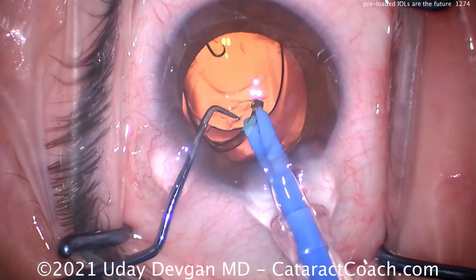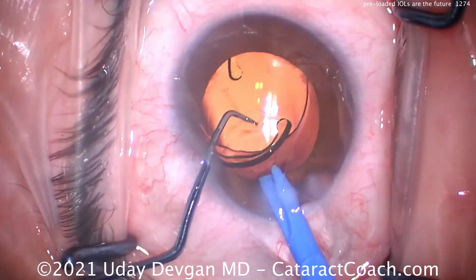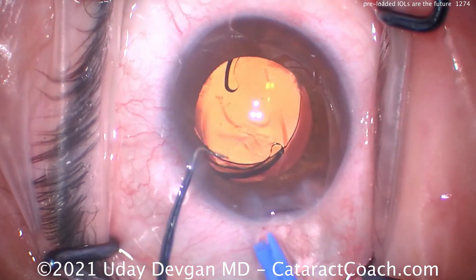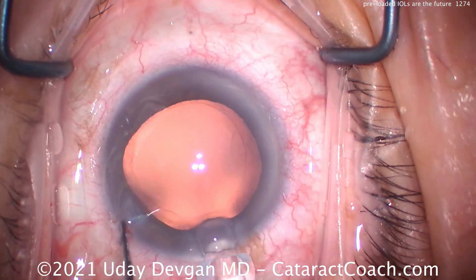If you need to, you can obviously come out of the eye and retry, but you should be able to use those two hands inside the eye at the same time. It comes out very nicely — a very controlled delivery. I'll show you again with yet another case.